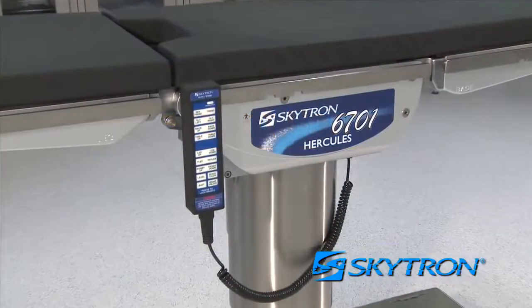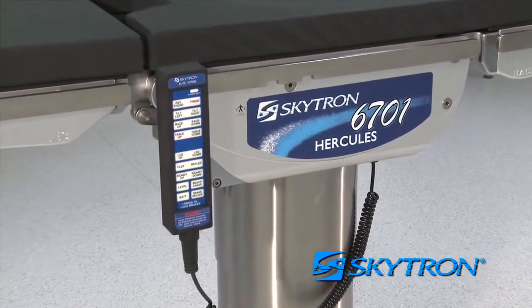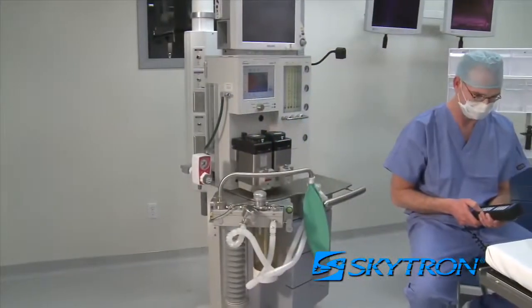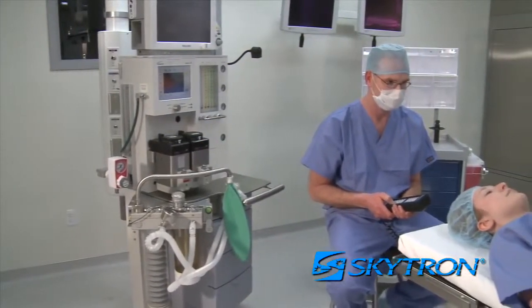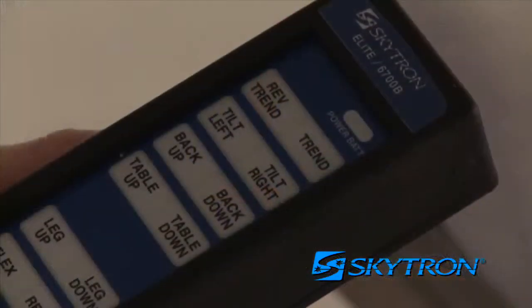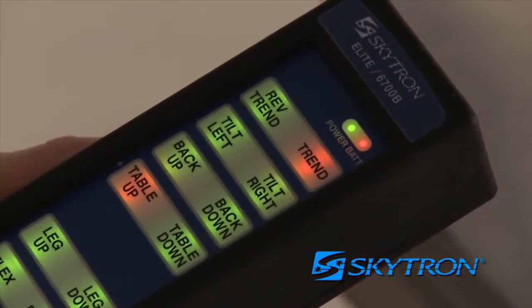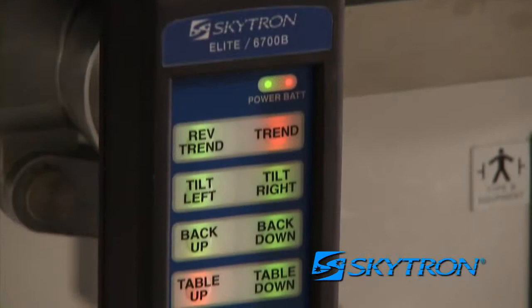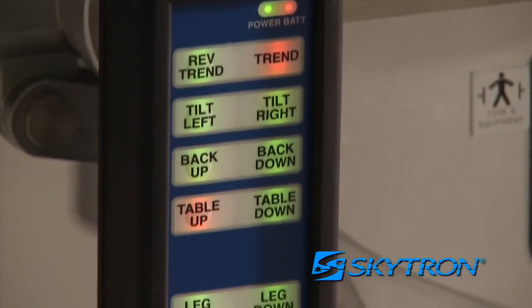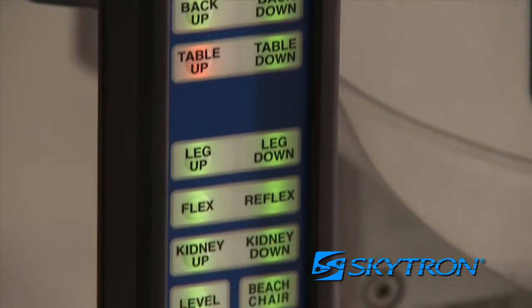Operation of the 6700 series table is accomplished via the handheld pendant control, which is typically operated at the head end by the anesthesiologist or nurse anesthetist. It is backlit for low light conditions, such as those required for minimally invasive surgery. All articulation movements for the 6700 series table can be controlled by the handheld control.